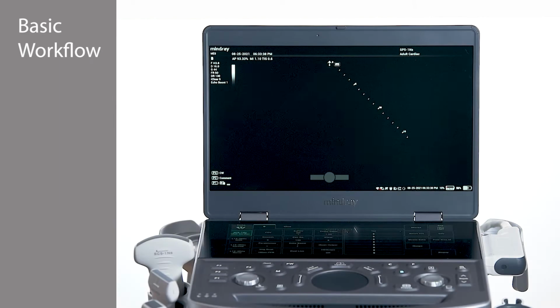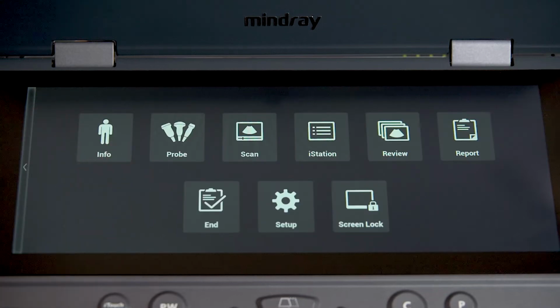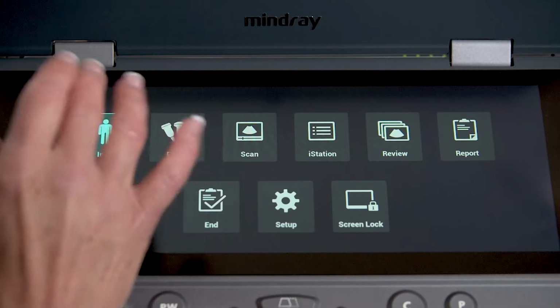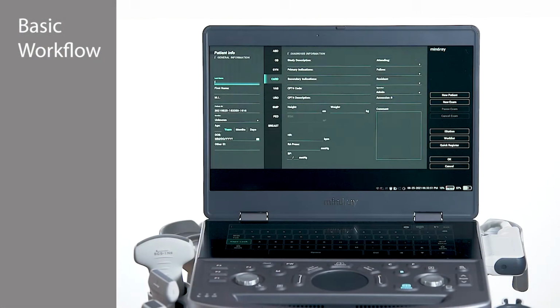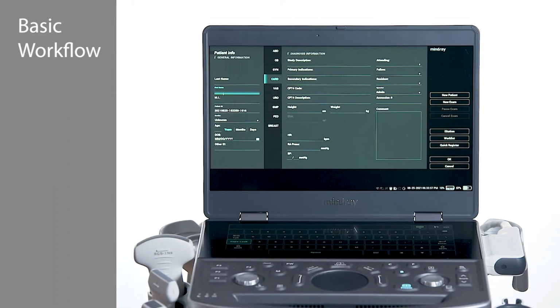The basic workflow of the ME8 is illustrated by accessing the main menu with the white arrow icon along the left or by swiping the touch panel to the right. Press the Info tab to access the patient information screen and enter demographics if desired. Use the trackpad and set keys to move through the data fields. The system will assign a generic patient ID that includes a date stamp if no data is entered.